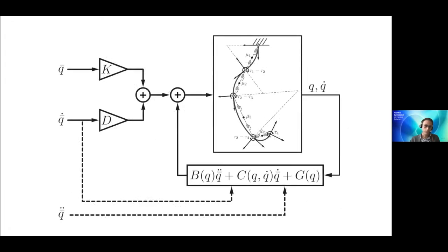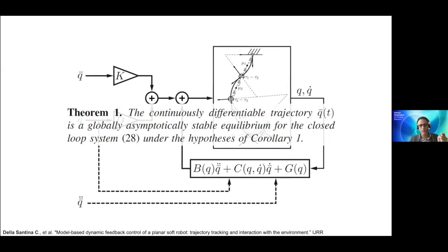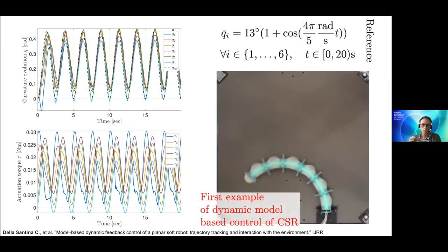And this is a block scheme of one of the controllers that we propose for that. It has a feed-forward component and a feedback component. And again, I will avoid details to not bore you. But what is interesting is that once you have at least a language to describe these systems, you can start proving things, and so have some reliability of what you are doing with respect to the performance, which is of course very important. But probably even more important is to see if it works in practice.